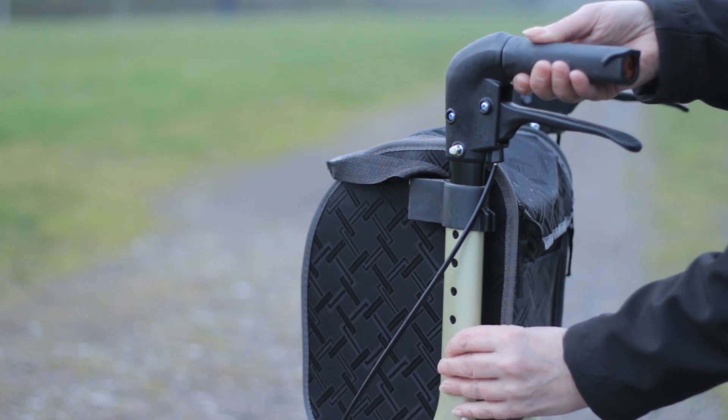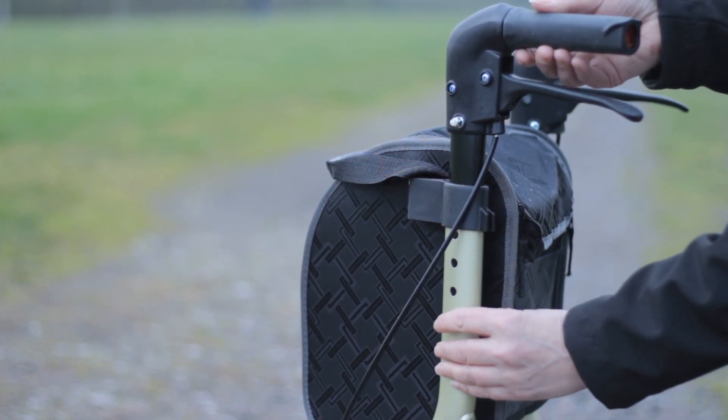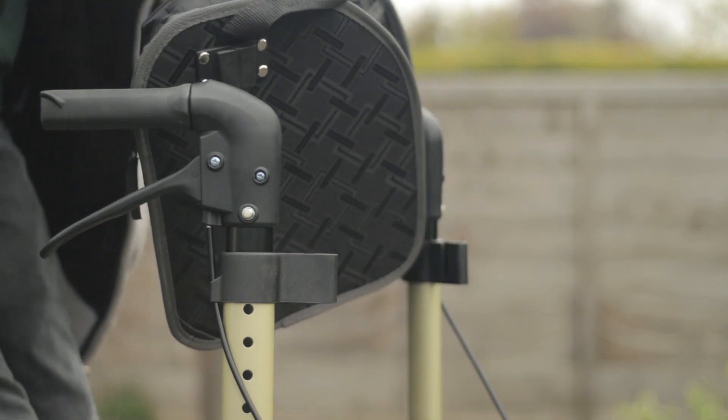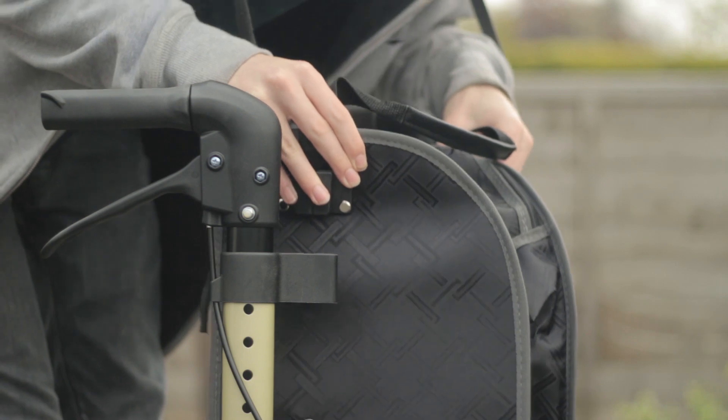The handles are easily height adjustable. The product also comes with an easily removable zippable carry bag that can hold items up to 5kg.